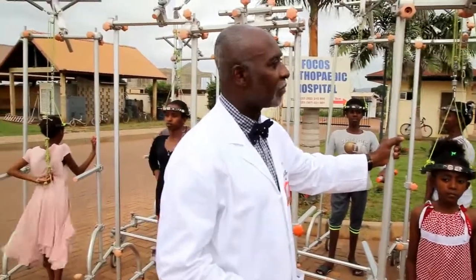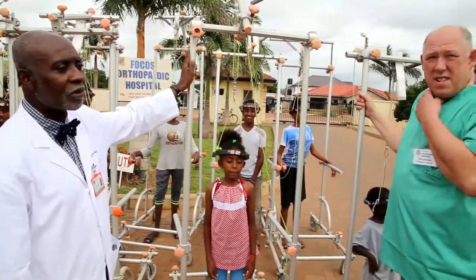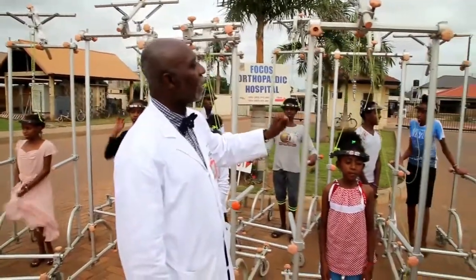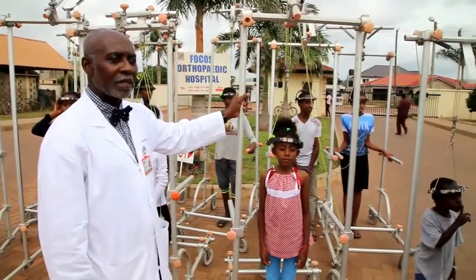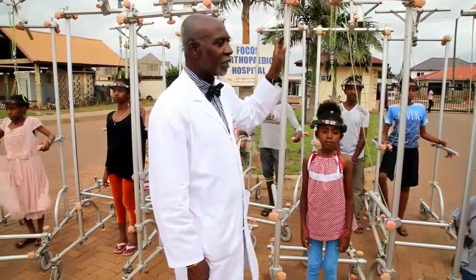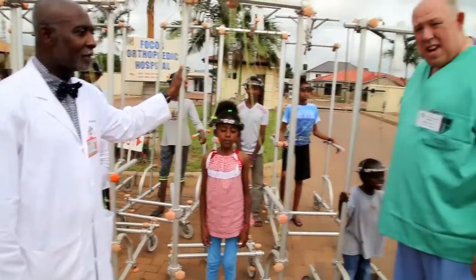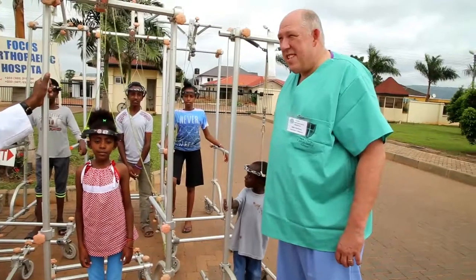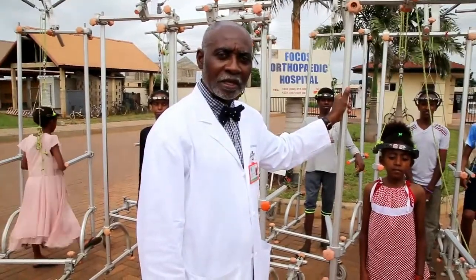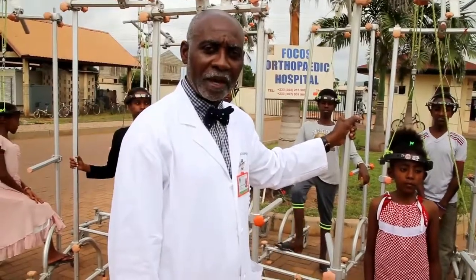Glenn has just gone through the spring-loaded traction system that we've used in hundreds of patients with excellent results. Here is a group of patients who have had the apparatus mounted for them at Focos, and it has done remarkably well in correcting severe deformities prior to surgical intervention. If anyone is interested in the system, please contact us at Focos Orthopedic Hospital, or Glenn Garrison at the Hospital for Special Surgery in New York. You can also find Dr. Bawachi or visit orthofocos.org for more information on the system's setup and function. Thank you for joining us.